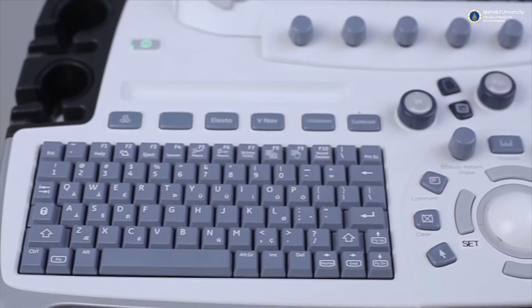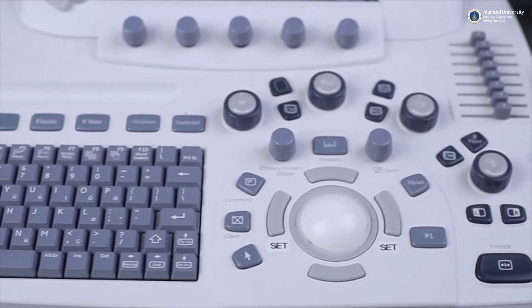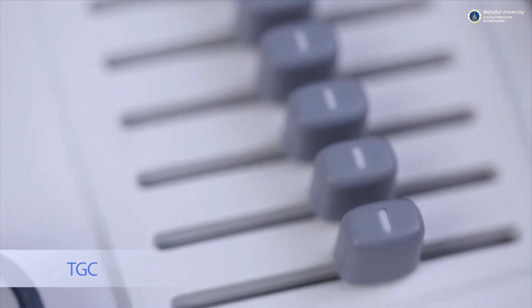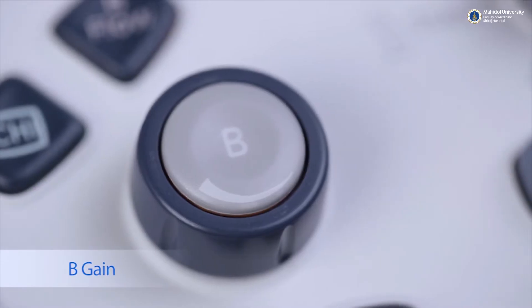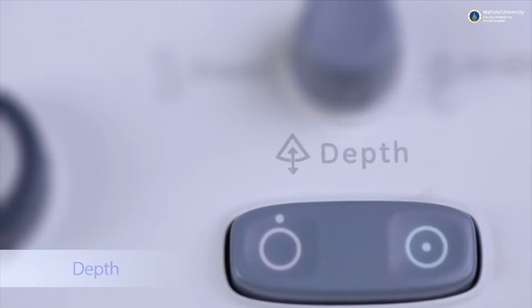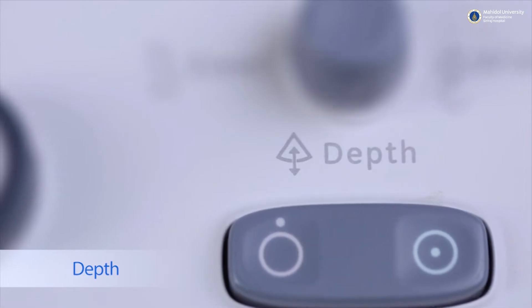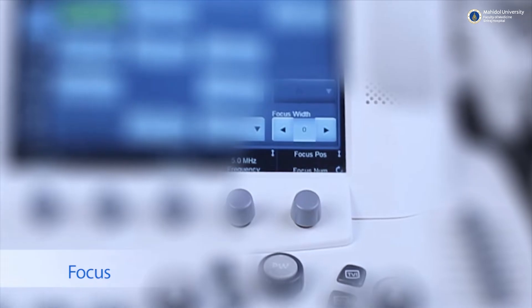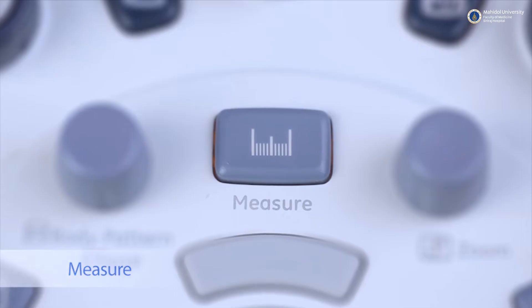The basic and commonly used ultrasound knobs are as follows: TGC slides for adjusting image brightness at different depth levels, and B-Gain knob for adjusting overall image brightness. The depth adjustment button makes the image larger or smaller, a focus image button provides the best quality image, and a caliper button is used to measure the size of a lesion.